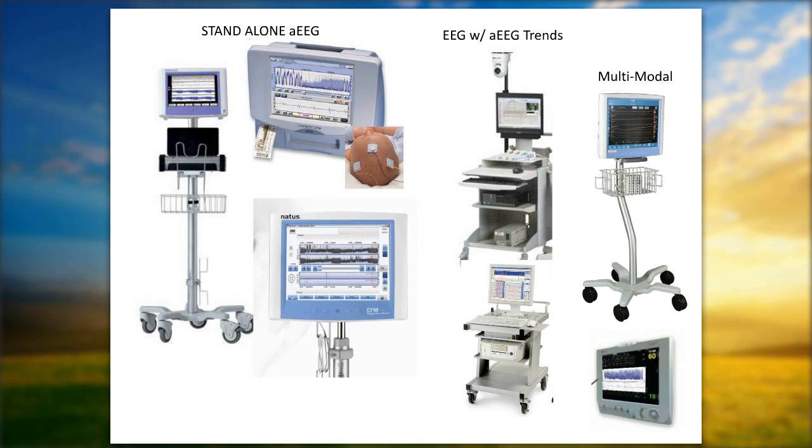So, those are some of the advantages, but if you're borrowing it from neurophysiology and you want it at the bedside, these are usually larger devices. You may have limited access to them because, again, they might be owned by another department. So it might be the NICU's responsibility to buy these instead of just borrowing. And they're a little more expensive. So that's one of those other things to keep in mind.